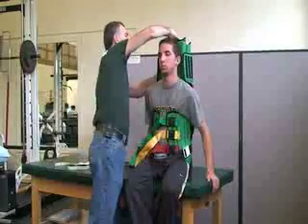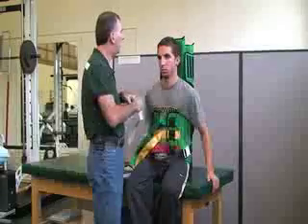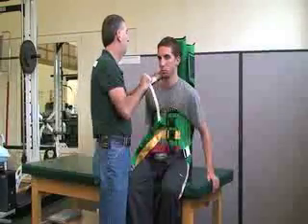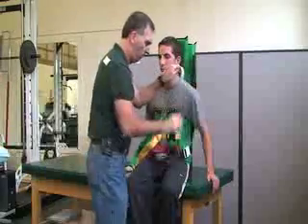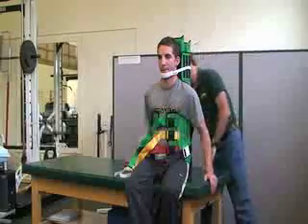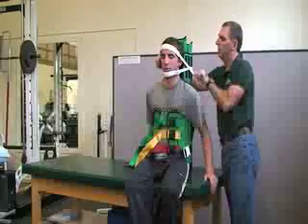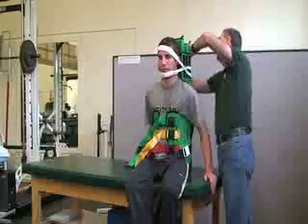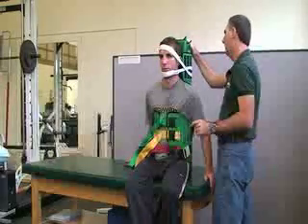We want to try to have the head as aligned as possible. There are two head straps that velcro on — one goes across the chin and the other goes across the forehead. If we had a cervical collar on, this head section can easily go over that. Velcro the straps onto the top piece, making sure the head is secure and in line.